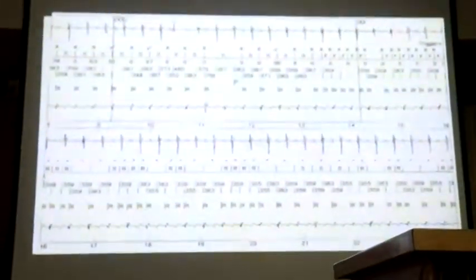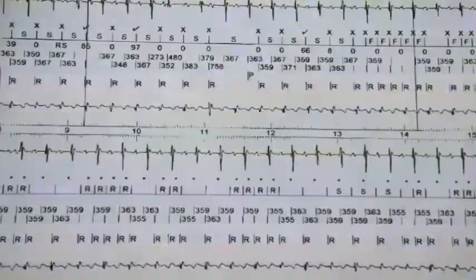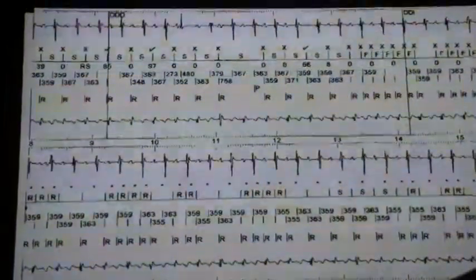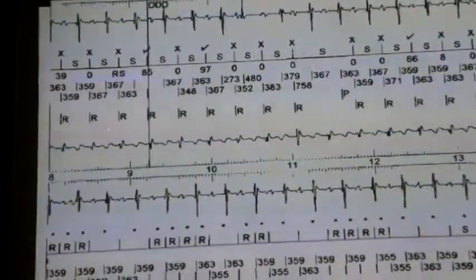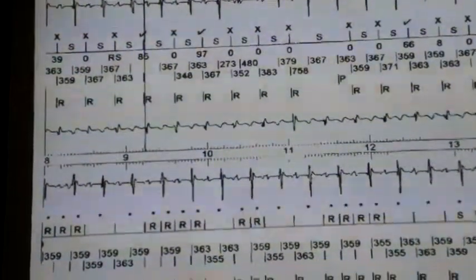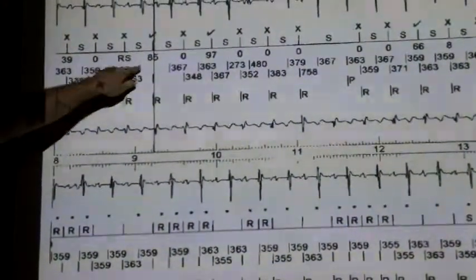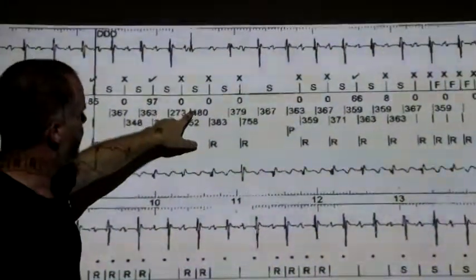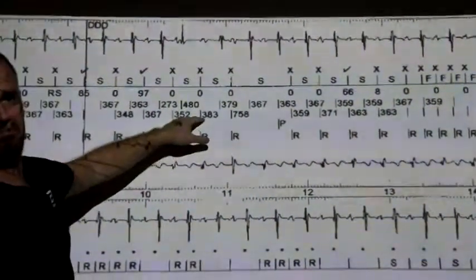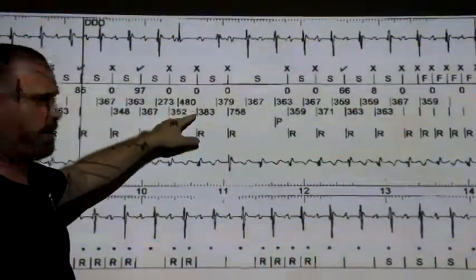So let's have a look at his episode. It's just like loads of markers, right? It's like it's too much, right? But work through it, it's okay. Atrial channel, ventricular channel, and then these are the markers. These things here. So this is the A marker on this device. V marker. A V A V A V A V A V. Early A. Bit of delayed AV nodal conduction. Interesting, but it's very early A, right?